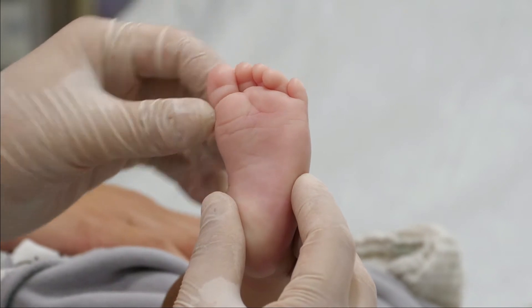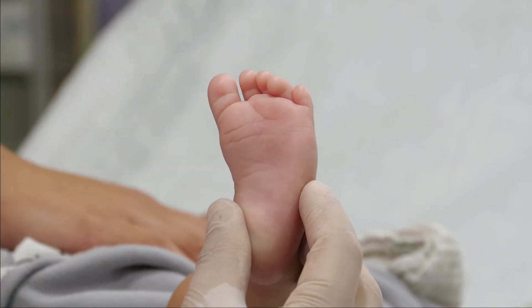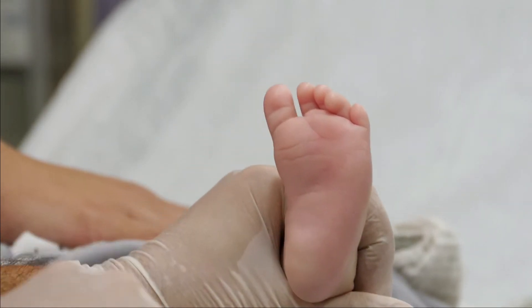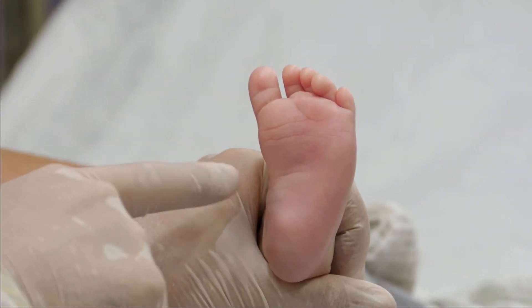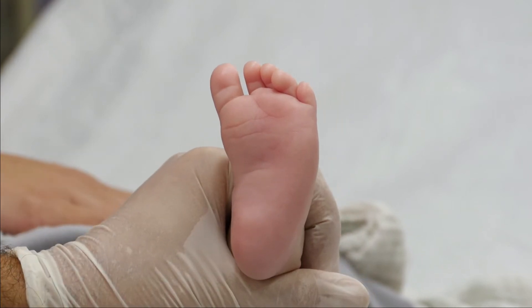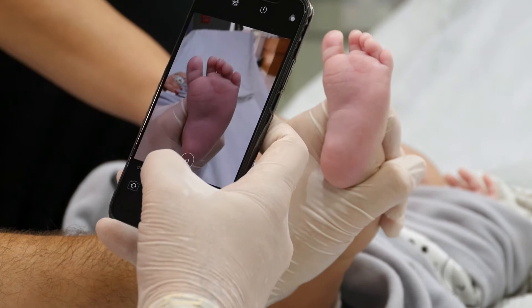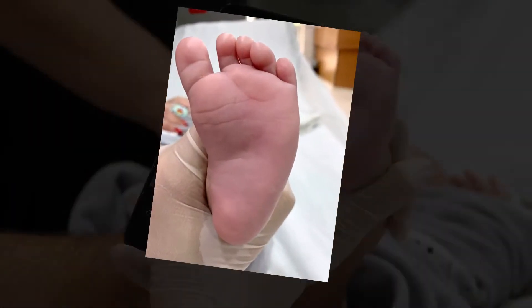The third examination checks the medial crease. If there is a medial crease, this parameter indicates a situation where the foot won't go normal without medical intervention. Before starting the therapy, it is recommended to take a picture of the foot to monitor therapy progress.